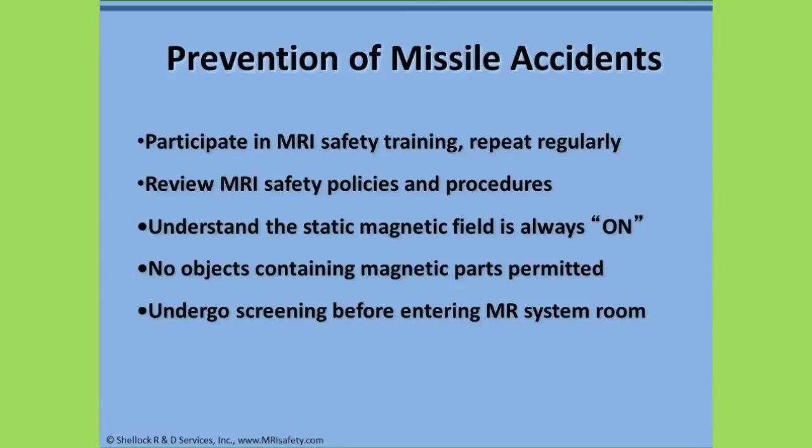Importantly, before staff members and other individuals are allowed into the MRI environment, they must undergo a proper screening procedure to ensure that there are no problems or issues that might pose a hazard in this setting. The screening procedure is also performed to ensure that all ferromagnetic or other inappropriate objects are kept out of the scanner room.